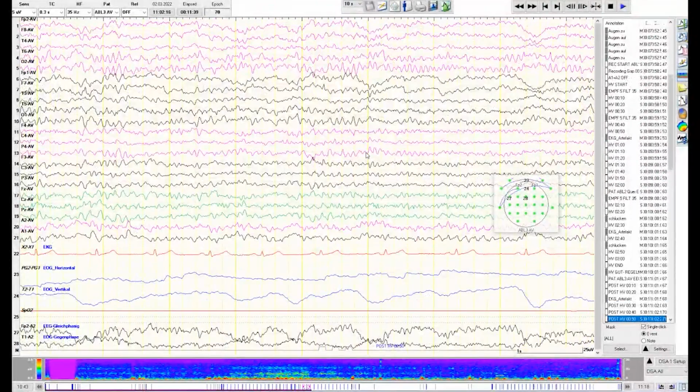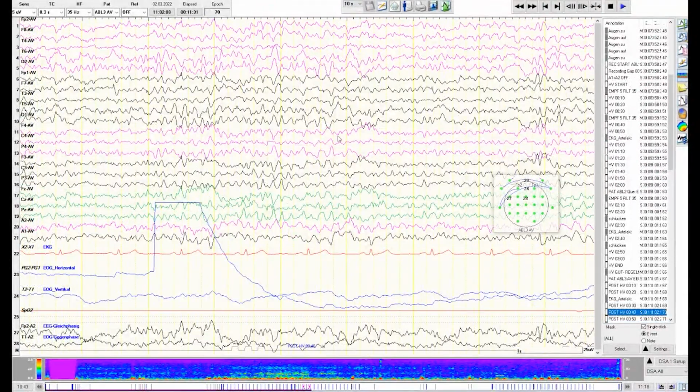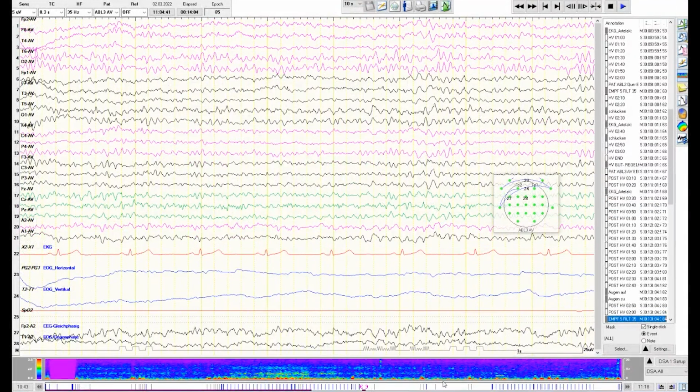The question for that EEG was whether this patient is suitable for ketamine treatment. We see there's some kind of focal slowing. We would advise that one should do an MRI, for example, to look for any focal things going on in the brain. However, there's no contraindication for ketamine in that patient, and that means he is eligible for ketamine.